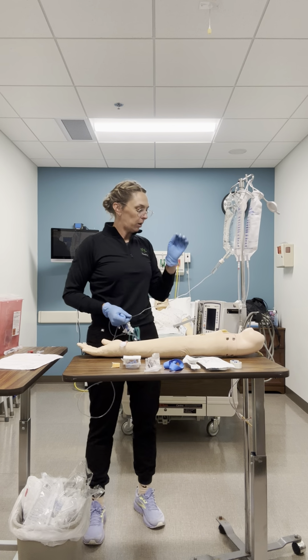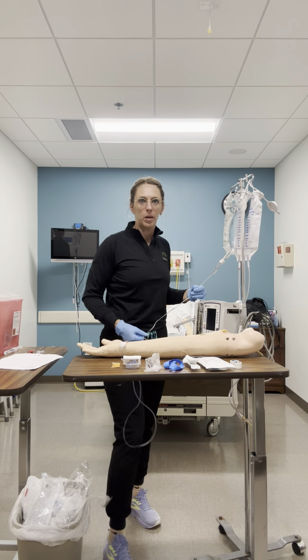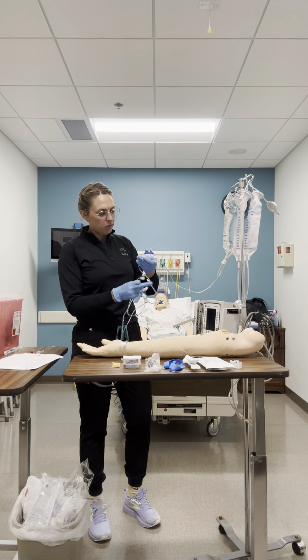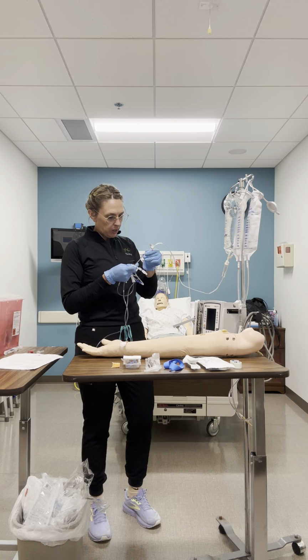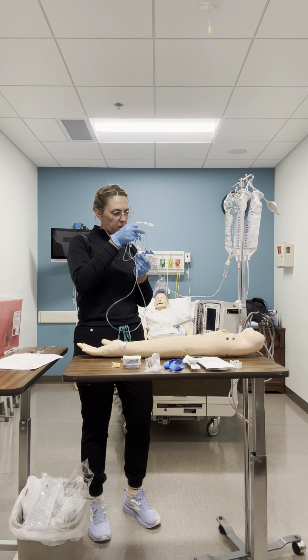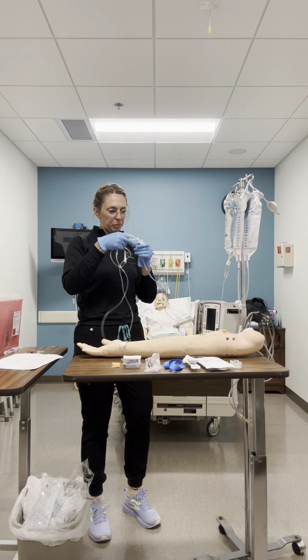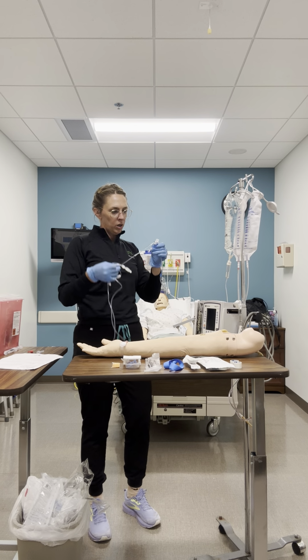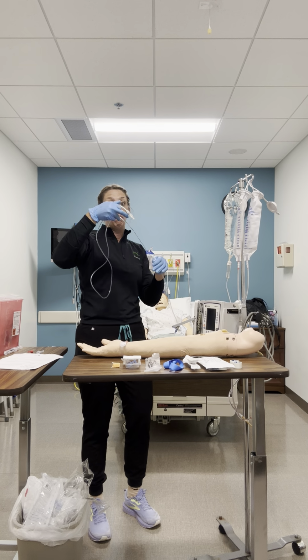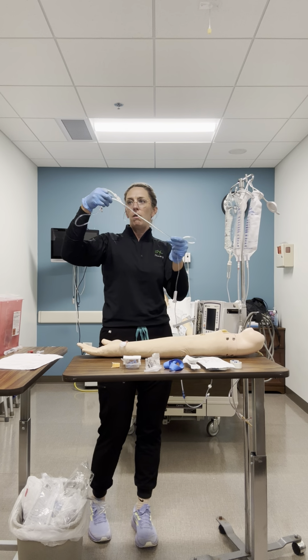And now I'm gonna check my tubing for any, just making sure my camera's still working. Checking my tubing for any bubbles bigger than a champagne bubble. And I don't see anything. As I come to each port, I'm gonna just flip it. We're making sure there's no bubbles. There are no bubbles in that one. I'm not seeing bubbles here. This looks pretty good. I don't know if you can actually see that on the video.